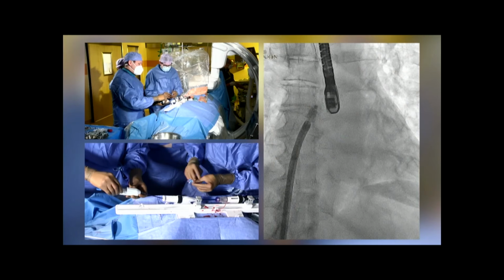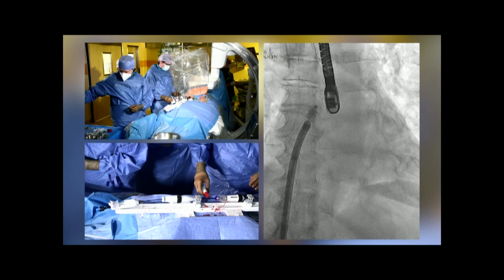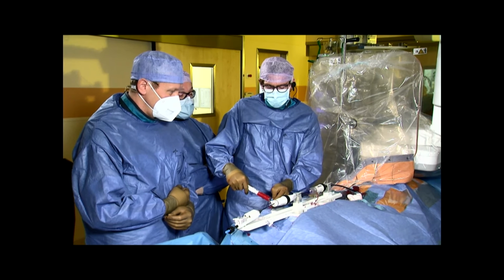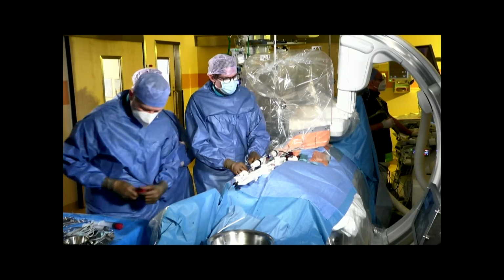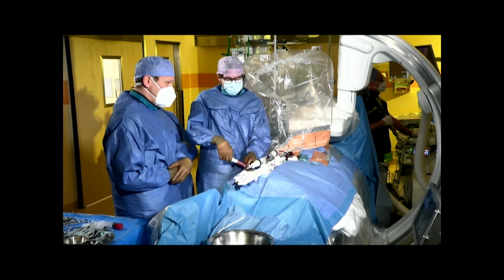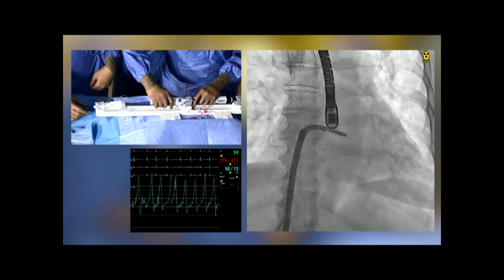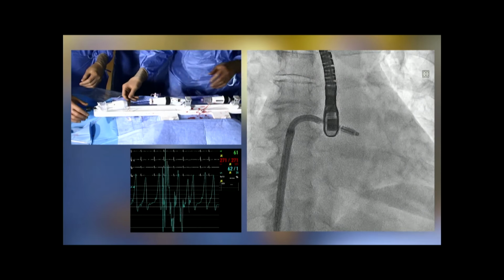Okay, so I think for this case and for most, we should make the most of the opportunity to measure pressures simultaneously. Do you do this on a regular basis? Yes, I really find it helpful. By the way, the reduction in left atrial pressure is also one of the strongest predictive measures in these procedures. Especially in this case, we have high LA pressures and a very significant V wave, and I very much hope and expect, if we do it right, this pressure to come down during the first grasp. Yeah, I do this as well. I always have left atrial pressure monitoring, because it tells you right away if you have a good leaflet capture when you close the system and if you have reduced the MR effectively, even faster than any echo assessment.